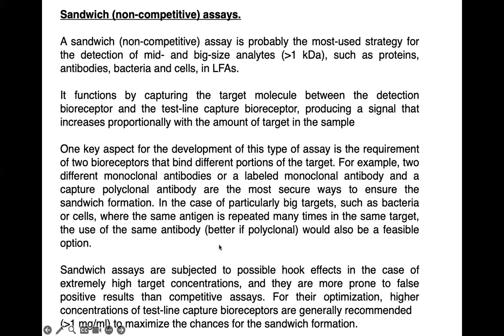And sometimes you wonder whether you should use monoclonal or polyclonal. Based on my reading, of course, monoclonal is much more selective, but of course, it is expensive to produce. It is suggested that polyclonal may be better because polyclonal antibodies have many more binding sites. So I don't know, that one actually has to be characterized by you, whether you want to use polyclonal or monoclonal.